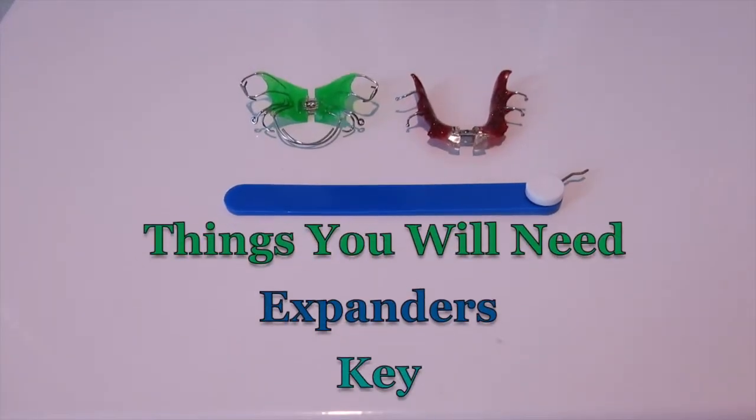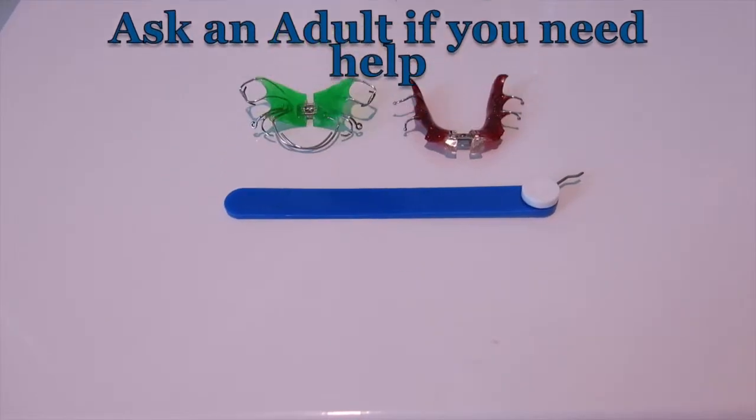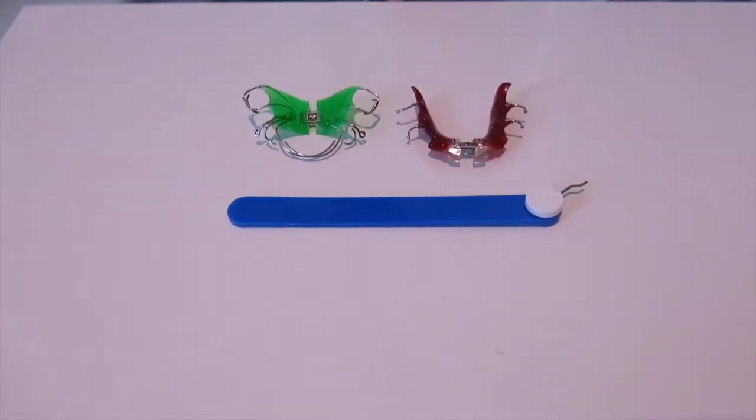Hi, I'm Carmina from Dentistry for Children and Families and I'm here to teach you how to turn your expanders. The things you'll be needing are your expanders, a key, and good lighting. And ask an adult if you need help.